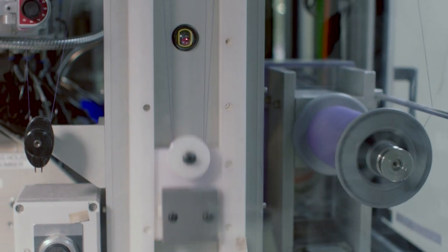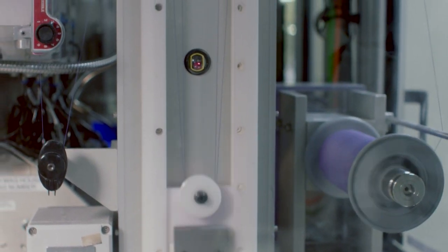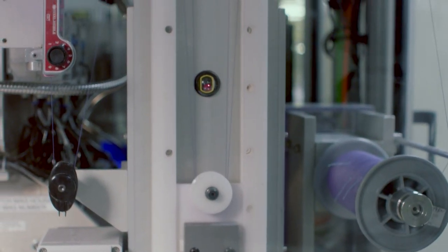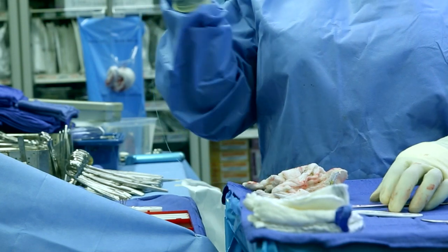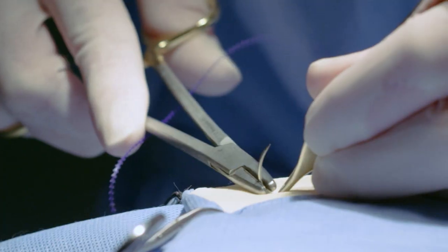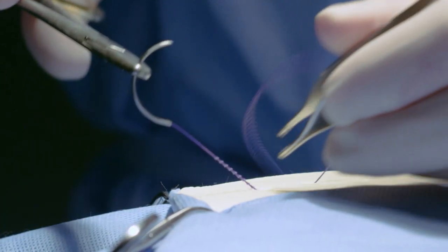Pull tests ensure that the thread will remain securely attached to the needle so surgeons can consistently trust that every pass will be secure.